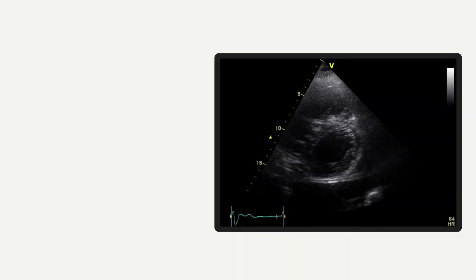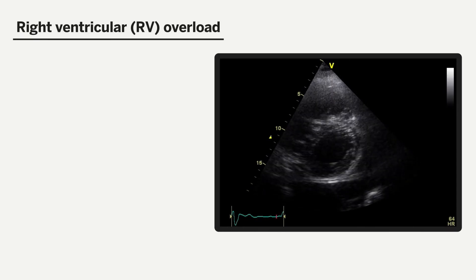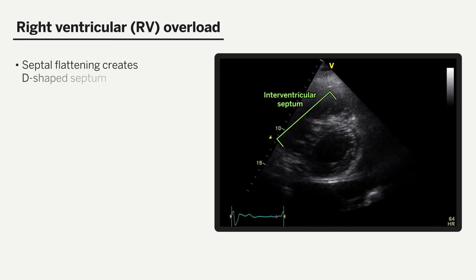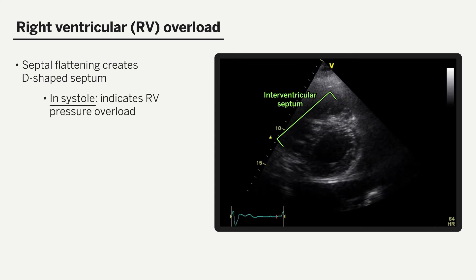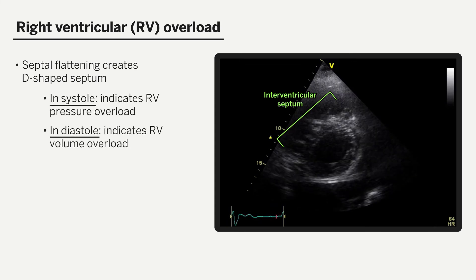Finally, the parasternal short axis view can be useful in the assessment of right ventricular pressure and volume overload. This is achieved by examining the interventricular septum throughout the cardiac cycle. Flattening of the septum creating a so-called D-shaped septum indicates right ventricular pressure overload if it occurs in systole, and volume overload if it occurs in diastole. In the example on this screen, we can see flattening of the interventricular septum in systole, indicating this patient may have an element of right ventricular pressure overload.